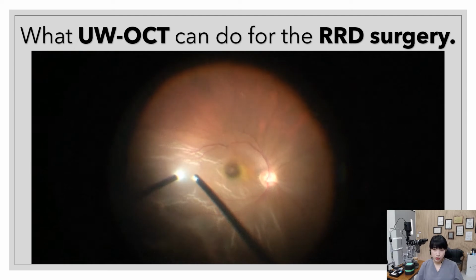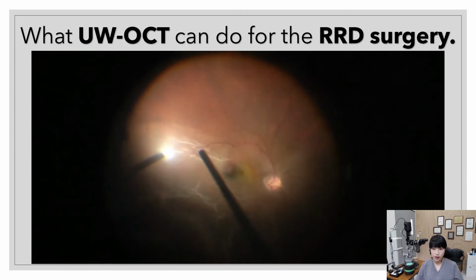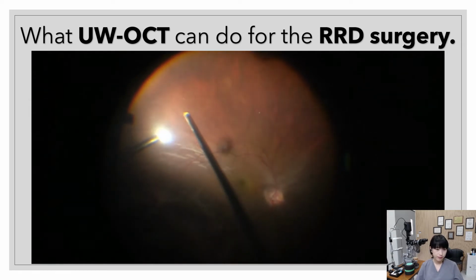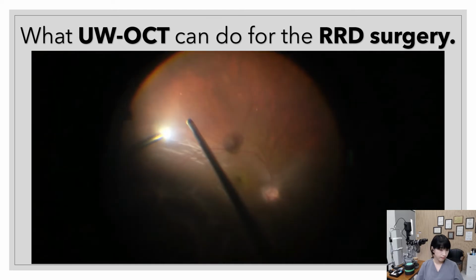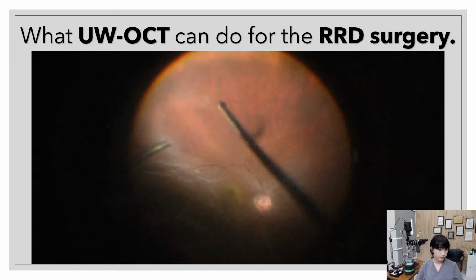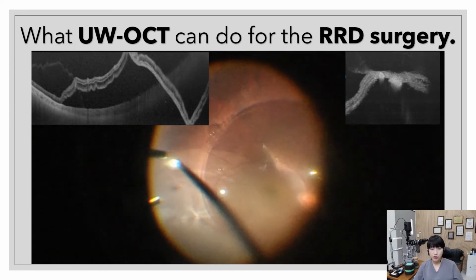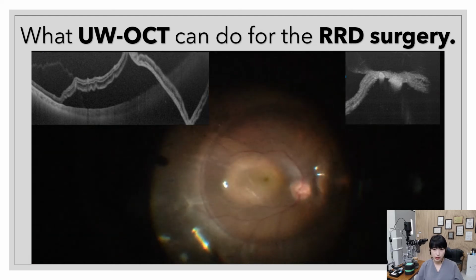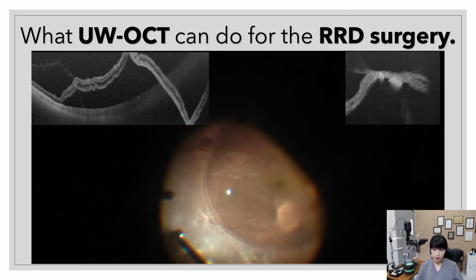This is the surgical video of the patient. I'm doing vitrectomy with the 25-gauge Constellation system. After a total vitrectomy, vitreous traction was removed on both the anterior and posterior sides of the retinal break, as we checked preoperatively with the Silverstone.